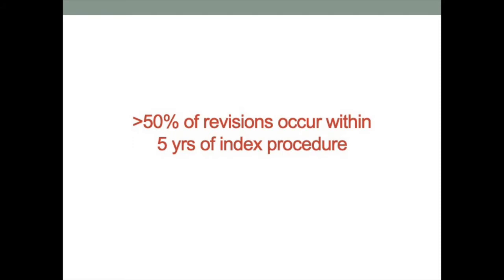procedure. So many of these may be owing to surgical technique or preventable issues, as well as patient-based issues that may have been prevented, such as risk mitigation prior to surgery and other things. However, sometimes there are structural failures or problems that can be completely unrelated to technique or patient-related factors.